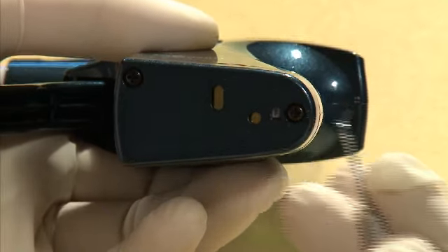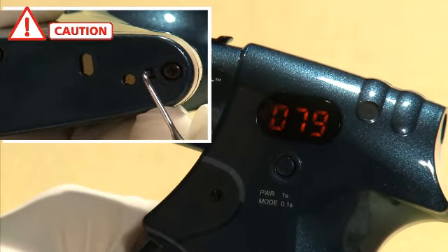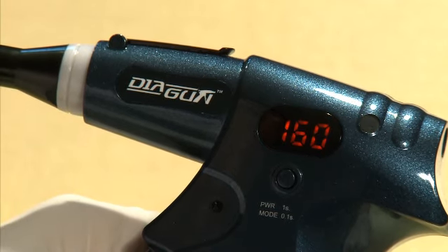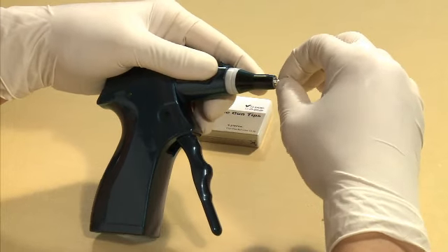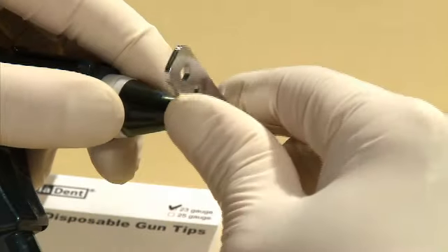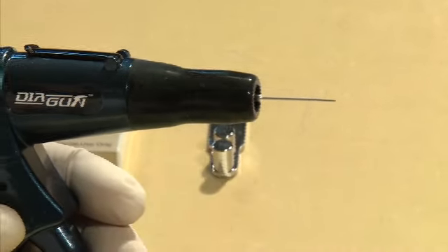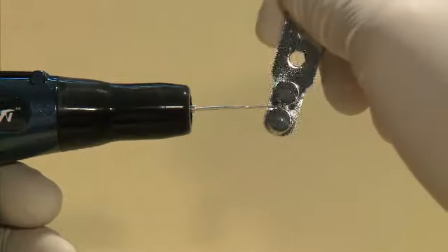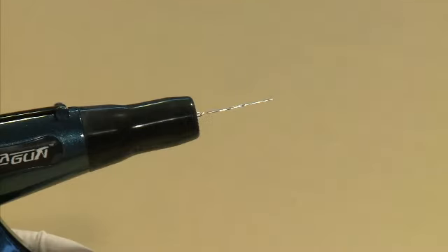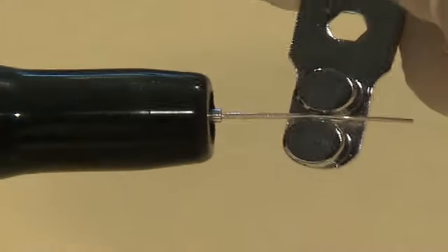Before using Diagun for the first time, it is extremely important to press the reset button located at the bottom of the Diagun handpiece. Failure to do so will result in Diagun malfunctioning in the future. Insert the gun tip into the handpiece and use the multi-purpose wrench to securely tighten the gun tip into place. Place the safety cap on top of the heat chamber to prevent possible injuries and burns. Use the multi-purpose wrench to bend the tip to the desired shape and angle — bending the gun tip by hand will result in damage to the tip; therefore, the multi-purpose wrench must be used.